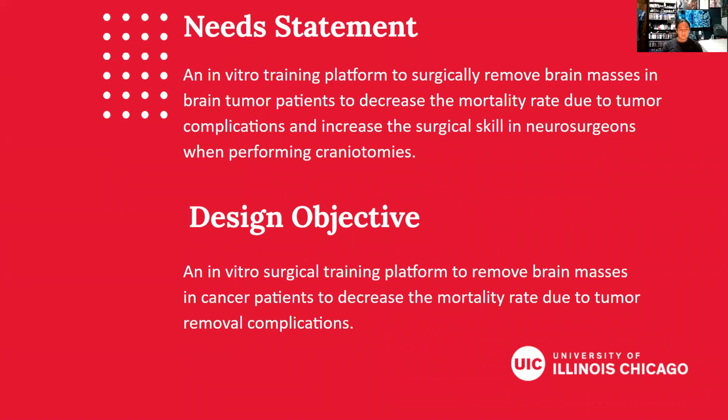Our need statement is an in vitro training platform for neurosurgeons conducting craniotomies to surgically eliminate brain masses in brain tumor patients in order to reduce the mortality rate attributable to tumor complications and improve surgical abilities. The design objective is to create an in vitro surgical training platform to remove brain masses in cancer patients in order to decrease the mortality rate due to tumor removal complications.